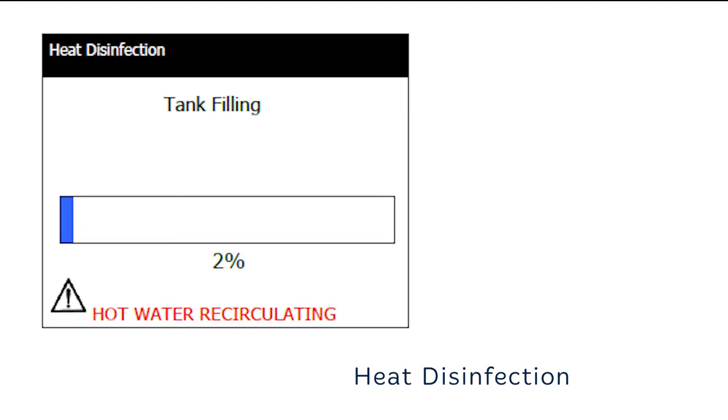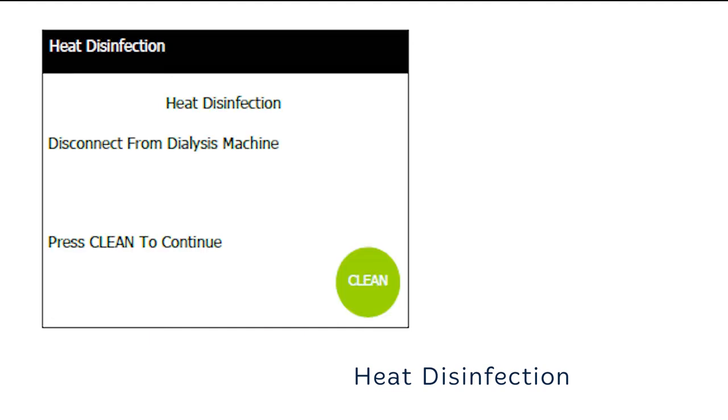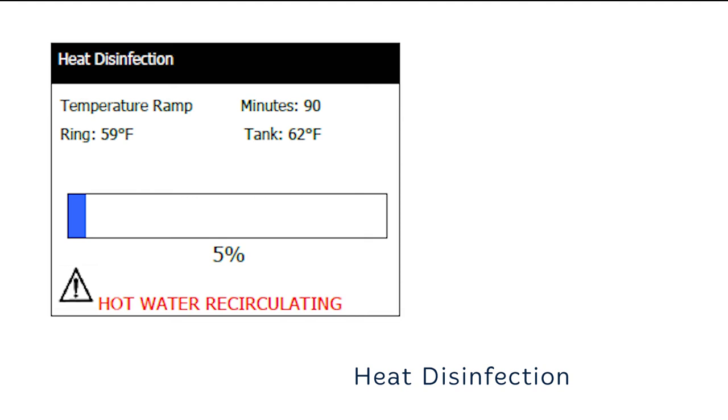At the start of the cycle, the unit's internal tank will fill with water. The process bar at the bottom of each screen tells you how much of the disinfection cycle has completed, and alarm and warning messages will also be displayed. Once the unit's internal tank has filled with the correct amount of water, you will be asked to disconnect the distribution manifold connection from the dialysis machine, to stop any chance of hot water entering the dialysis machine and causing damage. Select clean to continue. The unit will now carry out some internal safety checks. If all checks are complete, the unit will start to heat the water up. If the unit does not reach the temperature within 90 minutes, the unit will revert to a rinse cycle and the alarm message 'heat sand failure' will be displayed. If this should happen, refer to the user manual for troubleshooting.